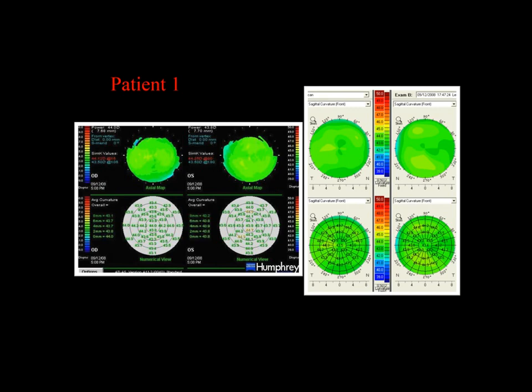And actually the pictures on the right, I've curtailed to only 9 millimeters. You can actually get beyond that. And the reason for that on a Placido is not only tear film abnormalities, but anatomically you can't bounce light off the corneal periphery and get it back to the camera. So it's optically and anatomically limited in how much corneal coverage you get.